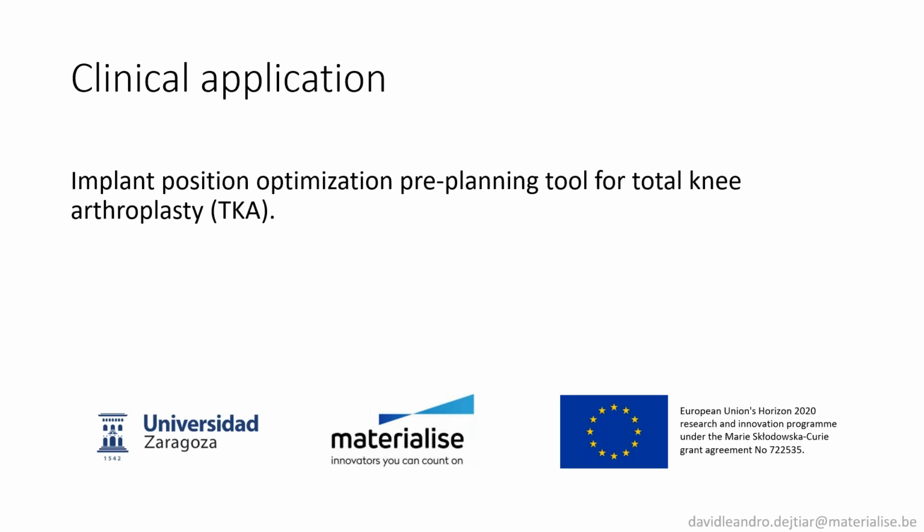So this application is what I'm currently working on. It's part of my PhD project funded by the European Union Horizon 2020 program, where I work at Materialise with the Universidad de Zaragoza as my doctoral school. Here I will explain the tool that we are developing to optimize the implant position in total knee arthroplasty.